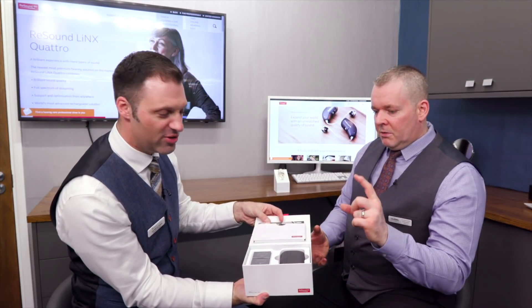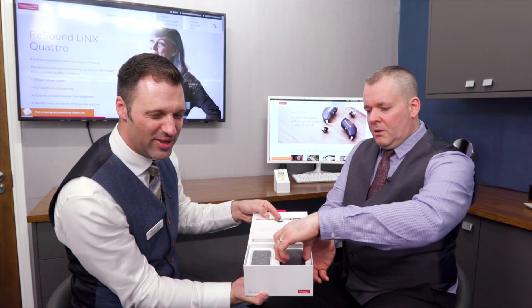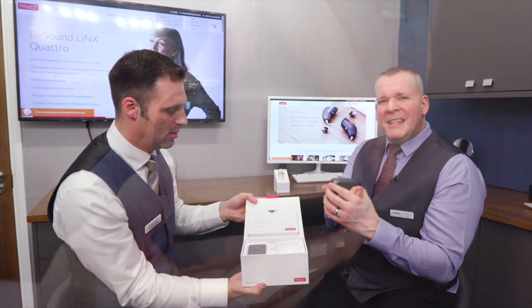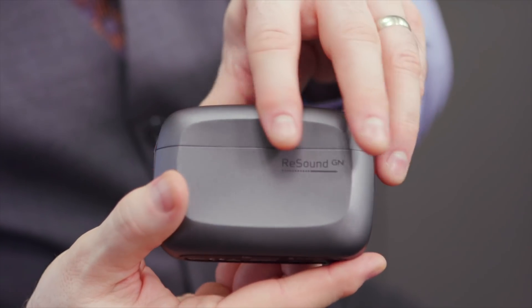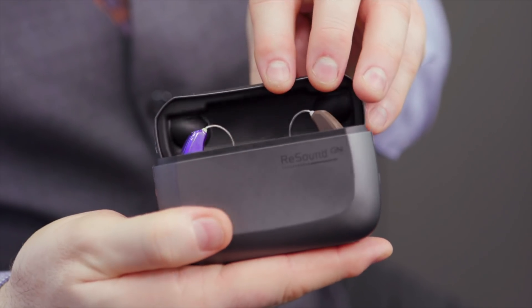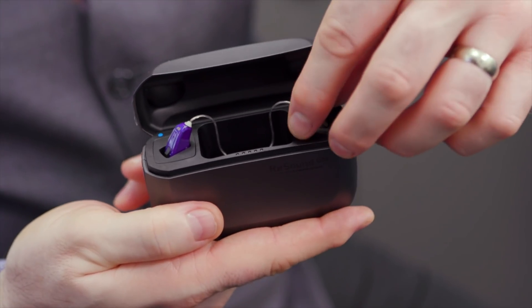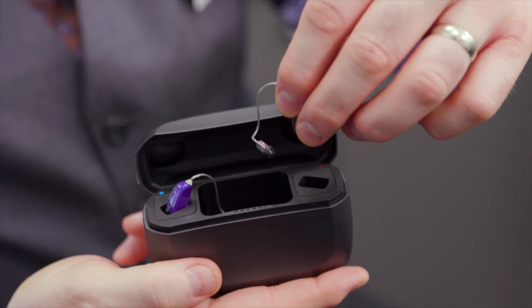Let's open it up. Now, these are the rechargeable versions - lithium-iron rechargeable. These are awesome. It's sort of weighty, it feels like good quality. And this is where your hearing aids will live. You've got a space for the left and a space for the right. When you put them in the charger - obviously plugged into the mains - it will charge up the hearing aids but also the cell within the charger.